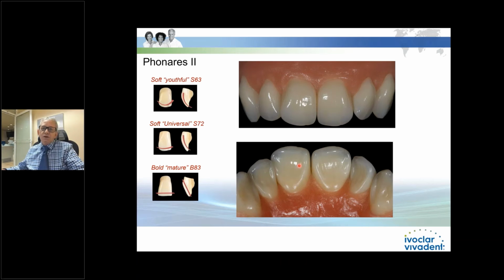But what I really like to show everyone, even with the patient, I always turn the denture to the palatal side. I always want them to see, because everybody sees the labial and the smile, but look at this. You have never seen a more beautiful tooth. Look at the opalescence. Look at it has a real cingulum. So I can actually make my wax proper, and believe it or not, when they start speaking, where does the tongue go? It hits this area. So if we have wax all the way up here and you come straight across because there's no natural cingulum, it affects the speech. So this is very nice and contoured properly.